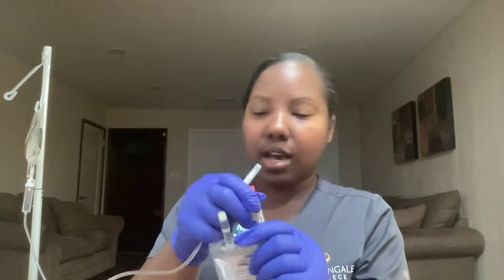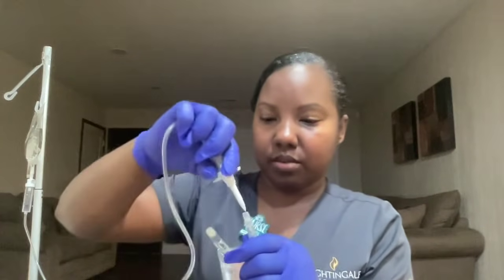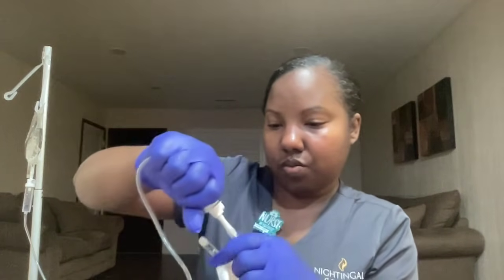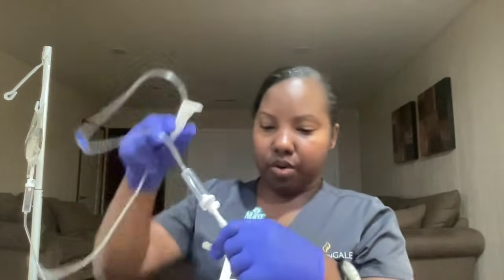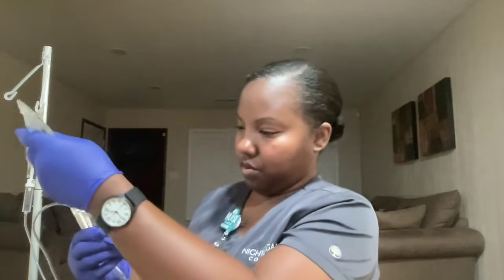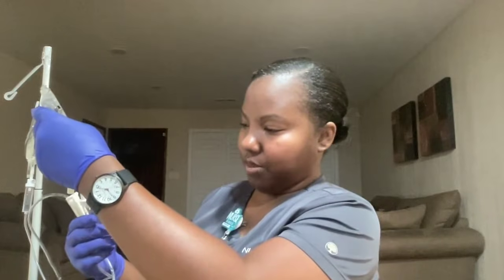Okay, so I am going to remove the top to the spike in. And I'm just going to put some drops in here.